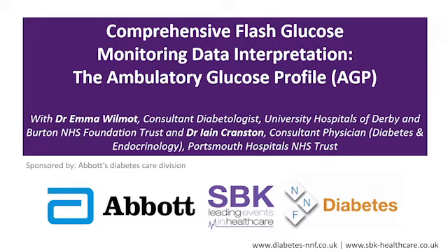And basically what that has come down to is that if you have a coefficient of variability above this magic figure of 36%, whatever the average glucose level you are achieving at the time, you will also have hypoglycemia risk. Whereas if you have a reduced variability than that, the chances are your hypoglycemia risk will be acceptable.